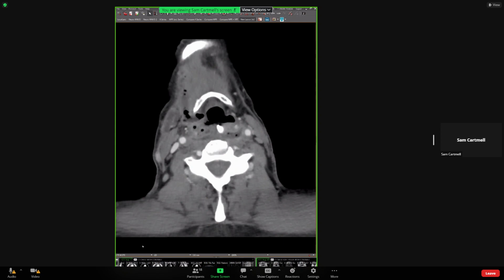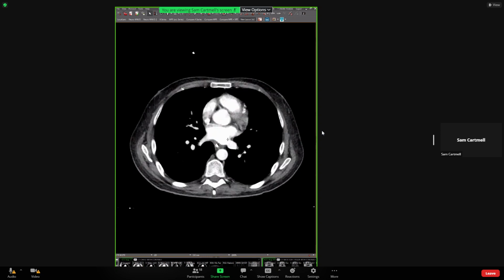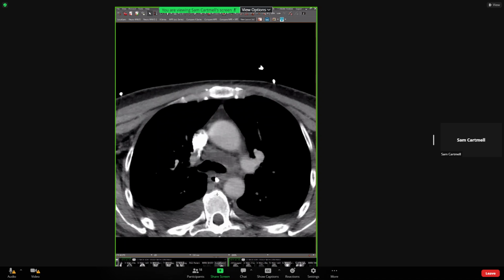mediastinal collection. I think this was visible on some of these priors, but not called until a little bit later. Like it's present here now. This was before the scan we were looking at in detail. So that is a sort of can't-miss kind of finding.